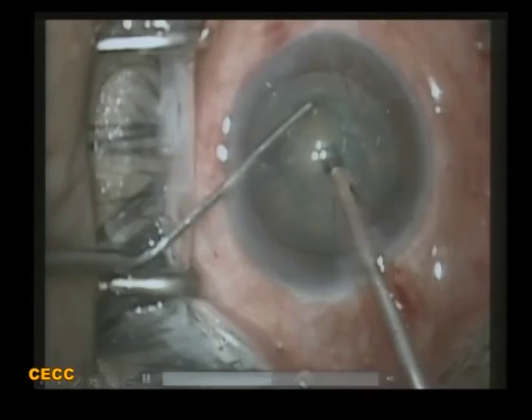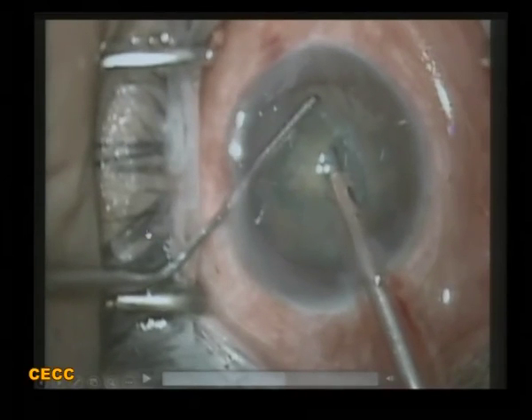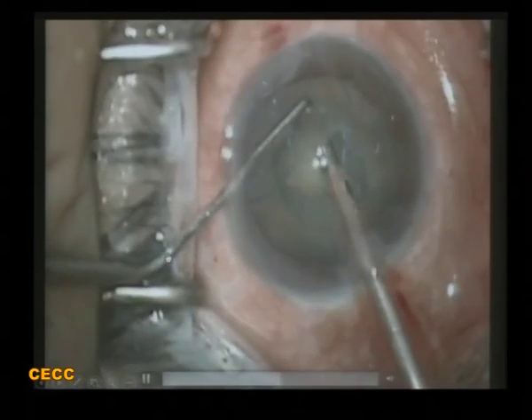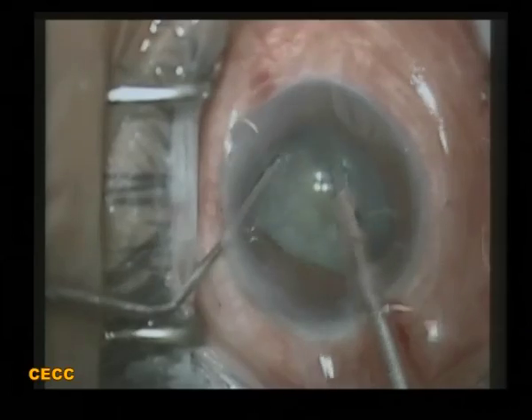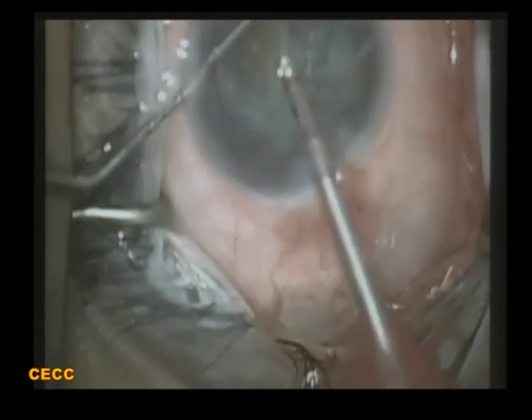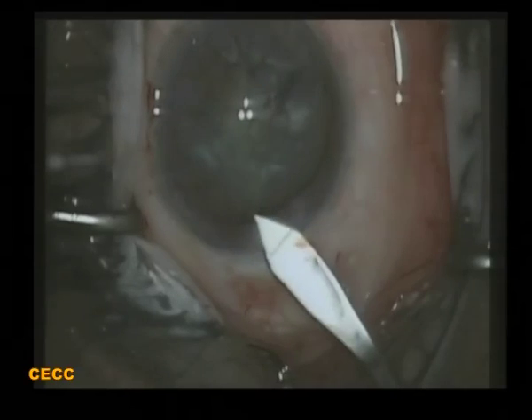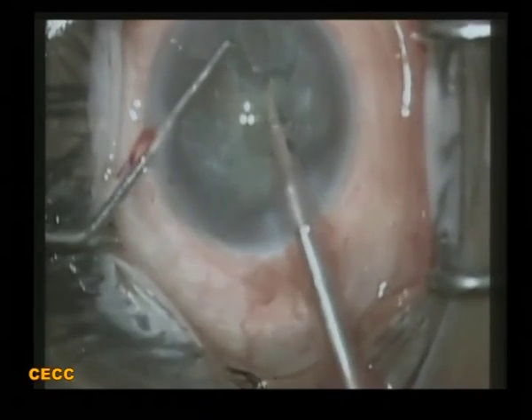In one such case where I was not able to enter the chamber completely, there was a partial entry into the anterior chamber with the blade. As soon as we bring the foot switch to position 3, the chamber starts collapsing. I am not able to go towards the nucleus — it's a stagnating feeling — so I have to enlarge and make a proper wound, and then things change completely.